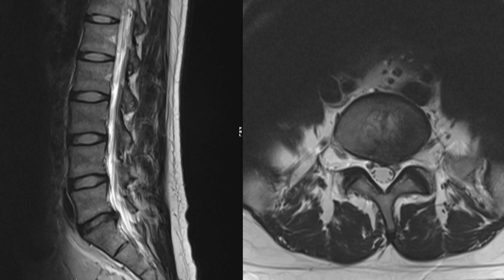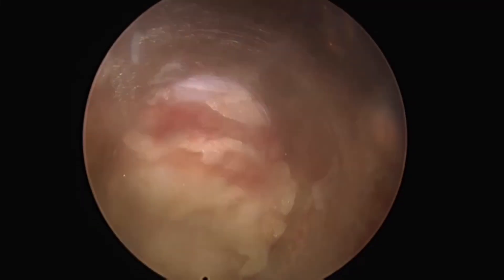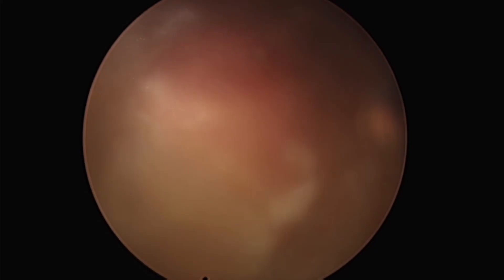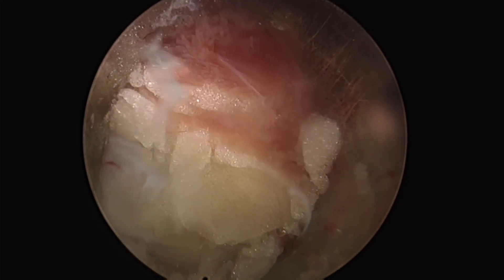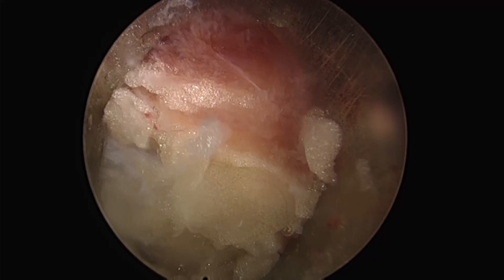The scope is inserted from a slightly caudal direction, utilizing the interlaminar space to its maximum extent. First, the sleeve is placed on the upper edge of the L5 lamina. This allows starting from the bone, reducing the burden of soft tissue handling.